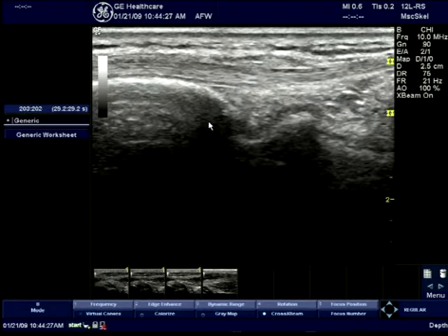The next image we would like to obtain will be the transverse images. I will first focus on the ulnar and then move over and look at the radial aspect. Those similar structures that we saw, you'll begin to see in cross section. You can see a very nice picture of the extensor tendons of the wrist and you begin to see the bones — the first is going to be the tip of the ulnar. As you move more laterally, you'll begin to pick up the other structures of the wrist, including part of the lunate and into the border of the radial head. Scanning more laterally directly over the radius, looking in transverse section, you see the fibrillar pattern of the extensor tendons of the wrist.